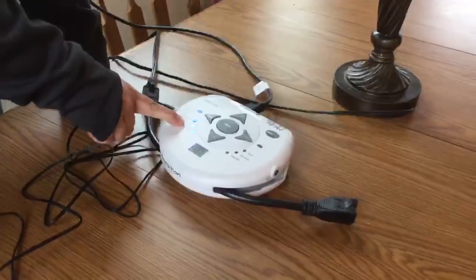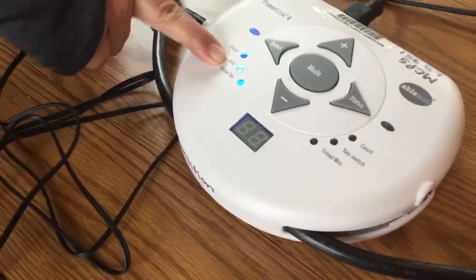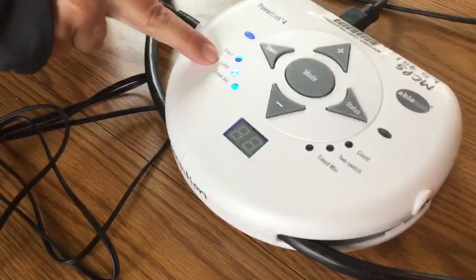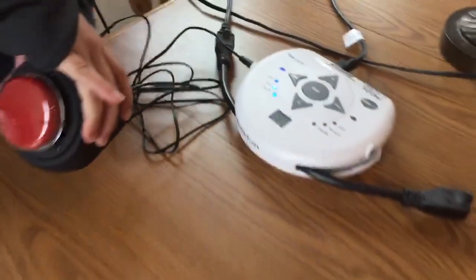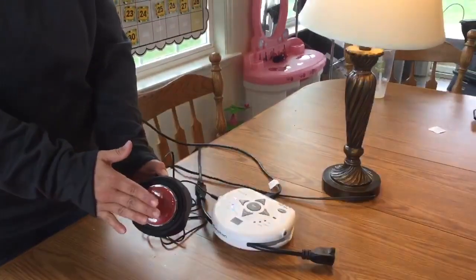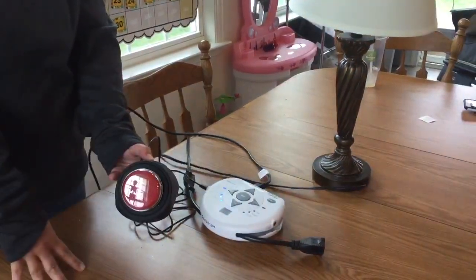Next, you're going to take your lamp and plug it into the power link. For a lamp, I would recommend that you use the latch setting. If it's not on that setting, touch the mode button until it lights up on latch. Now all I have to do is activate my step-by-step — and look, your light turns on. When you hit the button again, it will turn off.